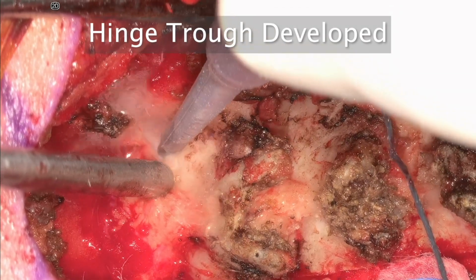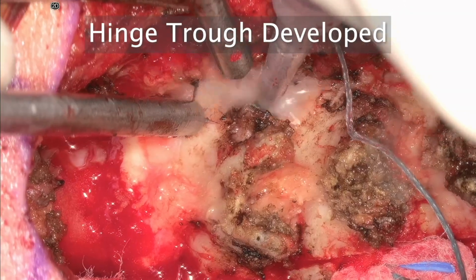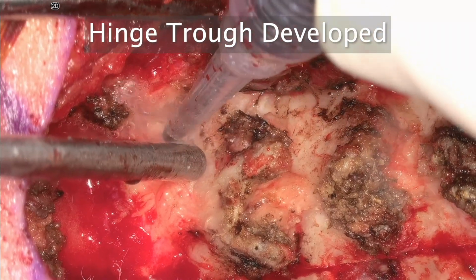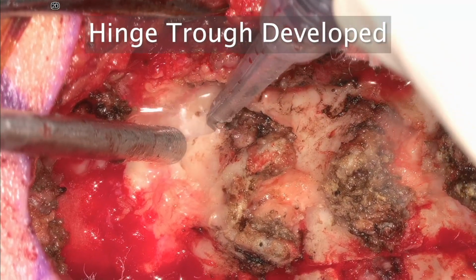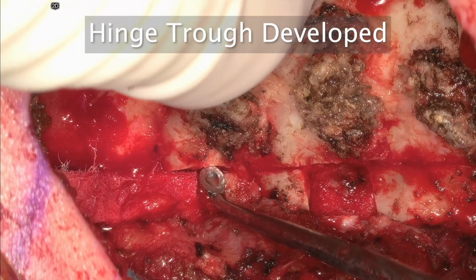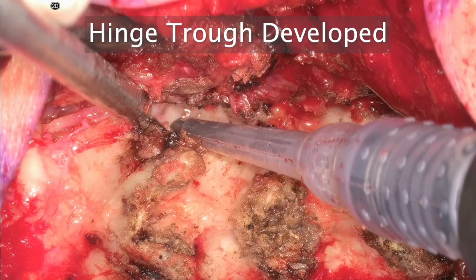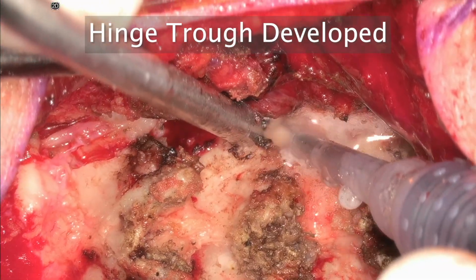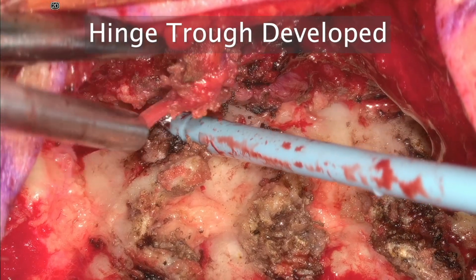All right. So on this contralateral side, we're developing that hinge trough. So we would be careful to not cut all the way through that cortex because we're going to be developing a greenstick fracture. As you can see, there is a notching technique that we're using. We're working at the superior aspect of the cortex, the inferior part of the cortex, and we work a bit dorsally as well to get through some of that cortex while leaving some at the end.